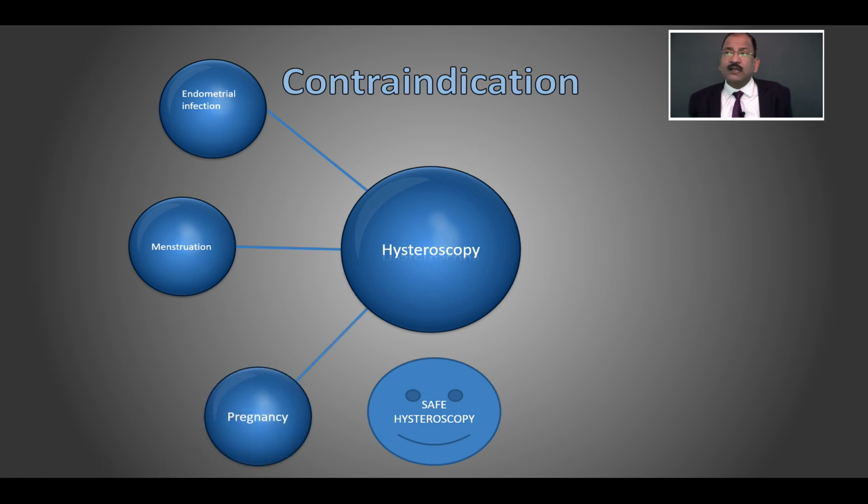Pregnancy is already a contraindication. But in some cases, they do hysteroscopic fetoscopy also. Do you know that? And in that, pregnancy will be there. Another indication of doing hysteroscopy in pregnancy is that sometimes an IUCD is there and the patient gets pregnant. Then by hysteroscopy you may remove the IUCD without damaging the fetus. But of course you have to take a consent for abortion, it may happen.